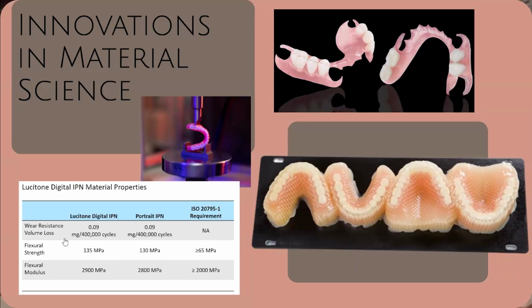We're starting to see and hear the flexibles. I mean, they are so close. There's one out there that I know of, maybe a couple, that doesn't have FDA full clearance yet, but there are 3 major players in this flexible printed resin market that are right on the edge of bringing it to bear for us. So we've all been waiting on that for a few years, and that will be exciting.